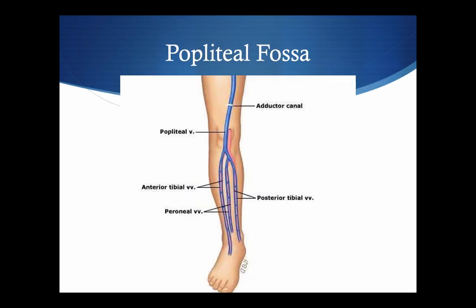the adductor canal. And then when you get to the popliteal, really just get right in the crease, peel back layers, apply some pressure, make sure you're deep enough, find the popliteal vein, and then track it proximal and distal until you see the branch points come off. And make sure everything that's not an artery is compressing. You don't have to identify that's anterior tibial, you don't have to do that. Just anything that's not an artery compresses.